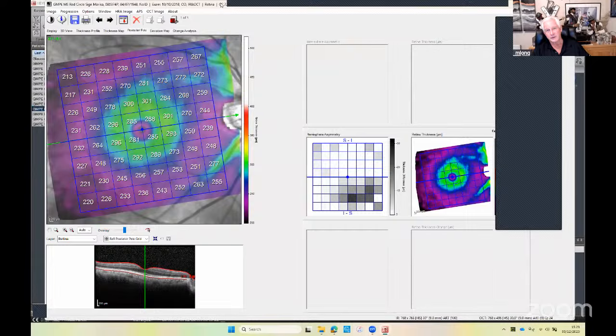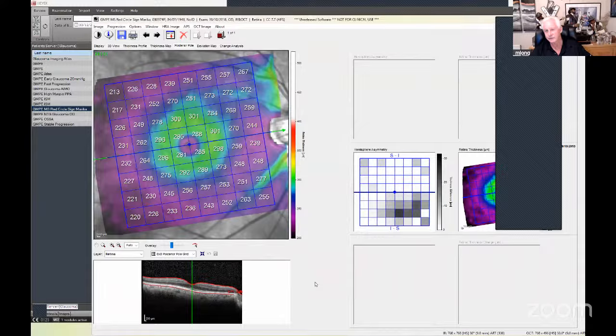Now look, you've got a purple eye. When you see a purple eye, that's a sign telling you that you've got a thin atrophic retina. Why have I got a thin retina? Is it because of neurodegeneration, because of glaucoma, or is it because of something else? What else would cause a thin retina?